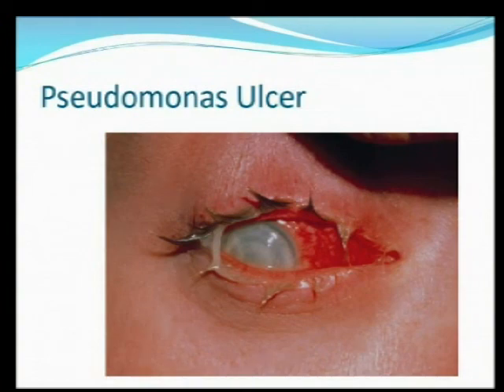She woke up one morning and the eye didn't feel right. It was red, but she just chalked it up to too much fun the night before. Did nothing about it. Left the lens in, which was the worst thing you could do. Left the lens in for another 24 hours, and by that following morning, that was her eye.